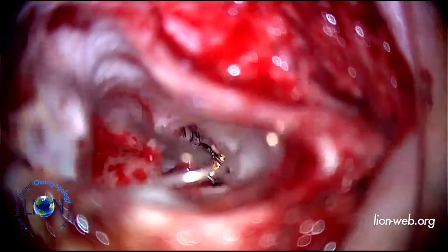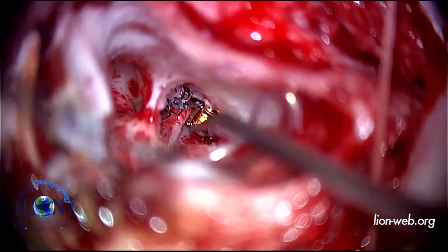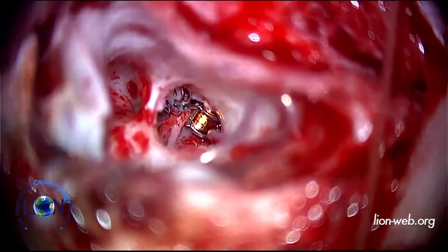The transducer was pushed onto the protympanum, and I check that there is no bony contact, in particular relative to the promontorium, which is not the case. So you see, yes, we see it fits very, very nicely. Thank you. Okay, fantastic. Thanks for showing us that.